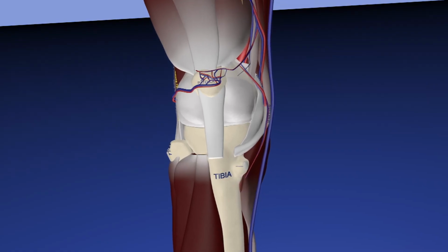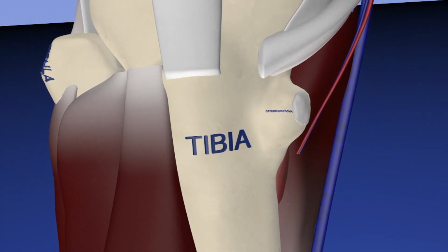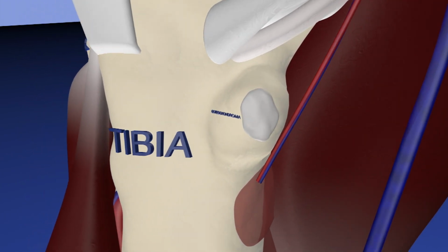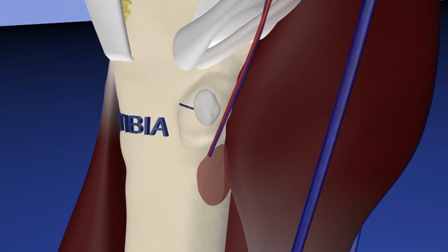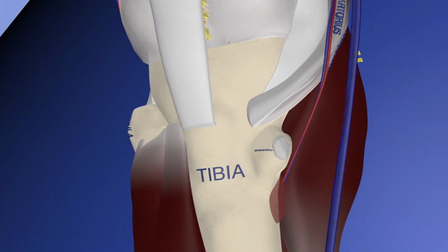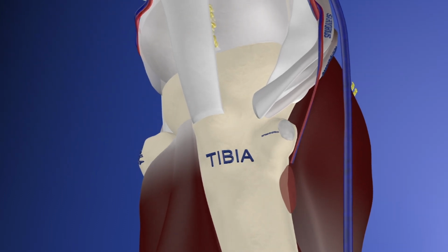Here is an anatomic model of this patient's lower extremity where she has an osteochondroma of the proximal medial tibia. There is a cartilaginous cap on top, which you can see here as well. And here we're just rotating, and you can appreciate that there is a little fluid collection inferior to this osteochondroma, which I believe is irritation perhaps from the osteochondroma rubbing on the medial gastrocnemius muscle, causing some bursitis or perhaps even a small hematoma in that region.